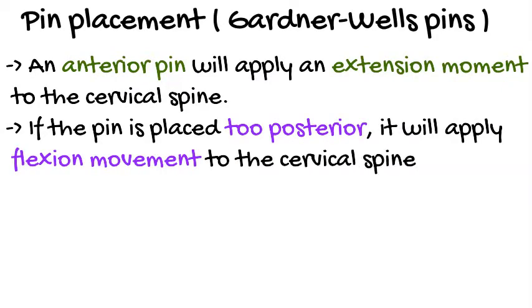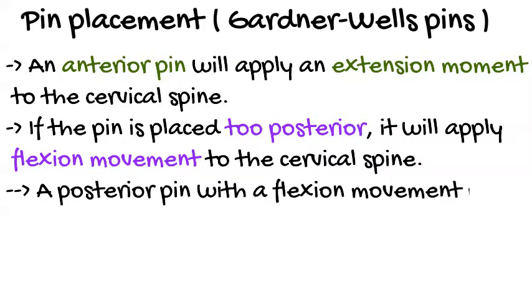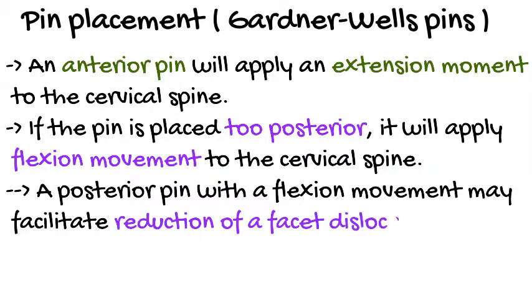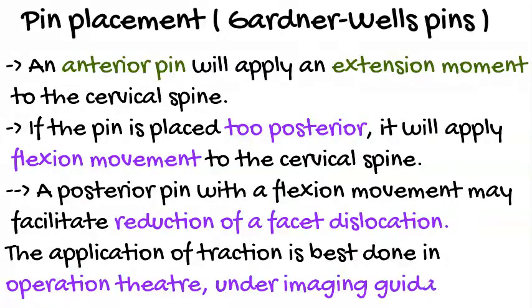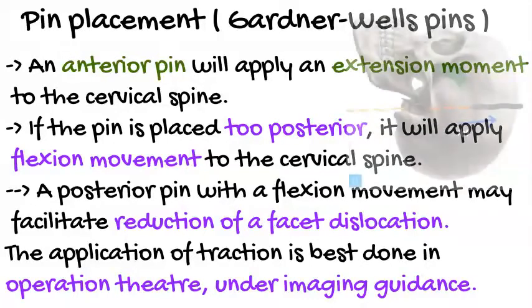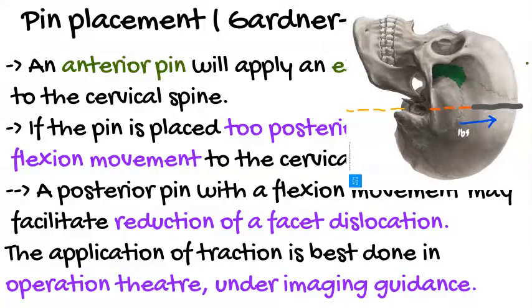If the pin is placed too posteriorly, it will apply a flexion movement to the cervical spine. A posterior pin with a flexion movement may facilitate reduction of a facet dislocation. The application of traction is best done in the operation theatre under imaging guidance.